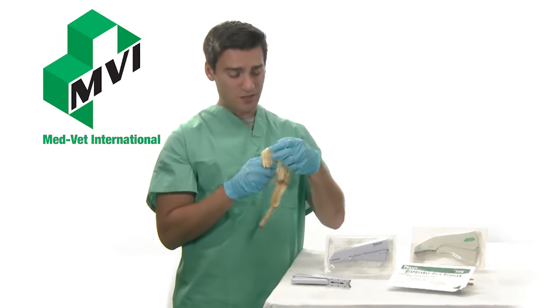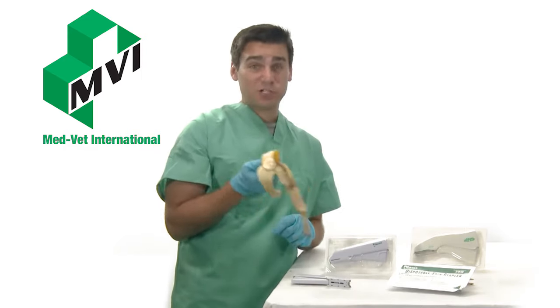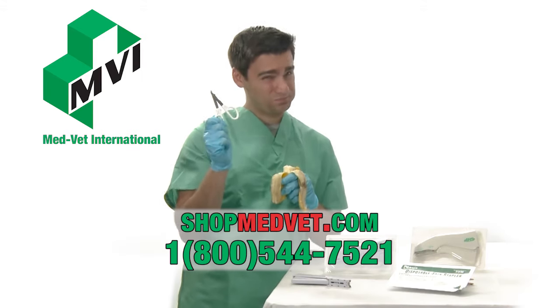They all sell for under $10 each. We have plenty in stock, so shop MedVet.com today. And don't forget to add the stapler remover to your order too — very important.